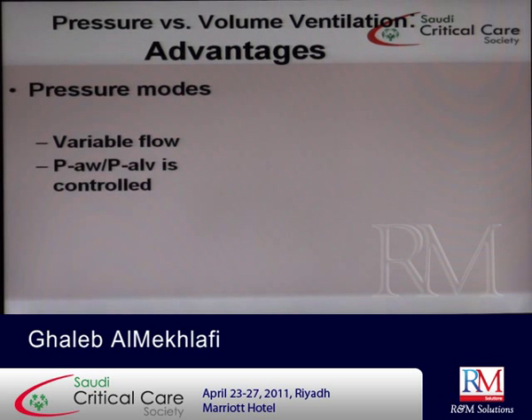So during pressure mode the patient is more comfortable and you need less sedation. And the pressure of the airways and the pressure of the alveoli is controlled. That means when you reach that pressure, the ventilator will cycle. What we mean by cycling is that it is pressure cycling. If I reach that target pressure I set for the patient, the ventilator will cycle to expiration. That's the meaning of it.